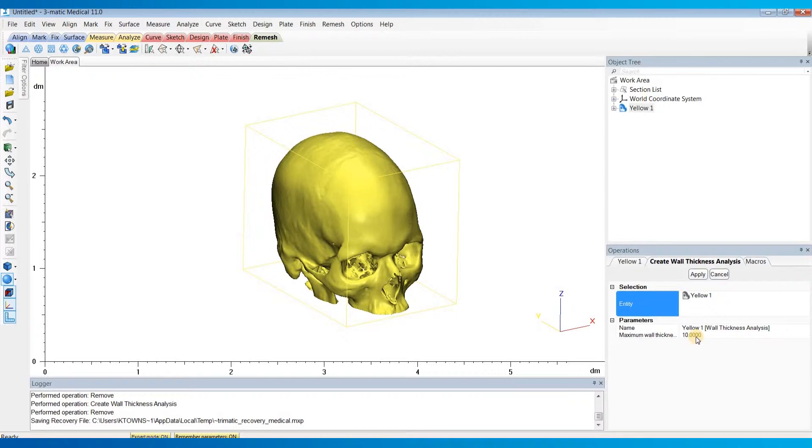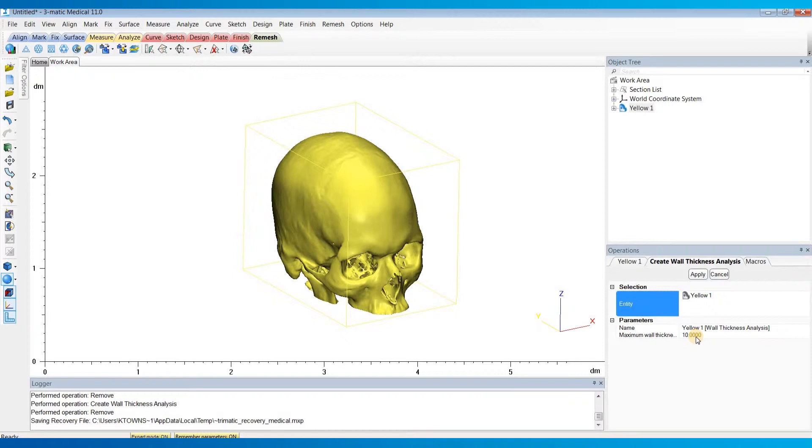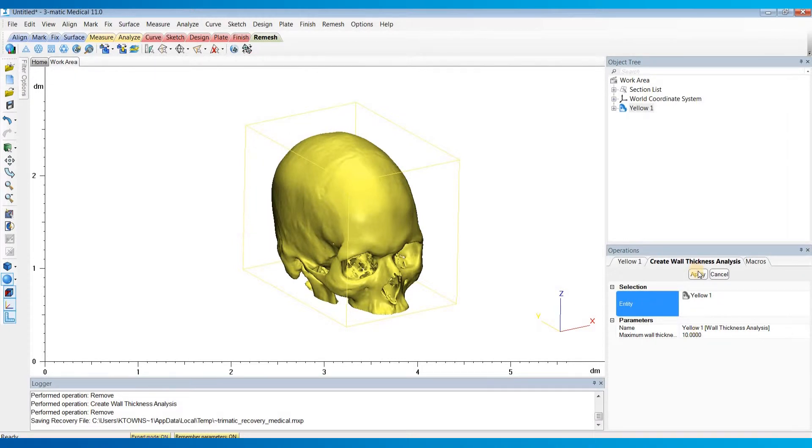And so I'd recommend setting this relatively high if you want to include all the elements, because any elements that are above this value won't be included in your analysis. So unless you're trying to only look at elements below a certain threshold, I would set this relatively high. If you don't set it high enough, you can always update it afterwards. So I'm going to go ahead and hit Apply and let this calculate.